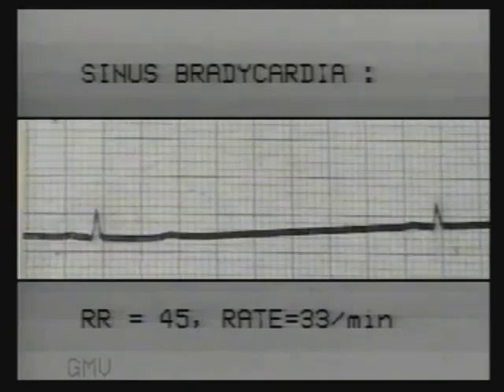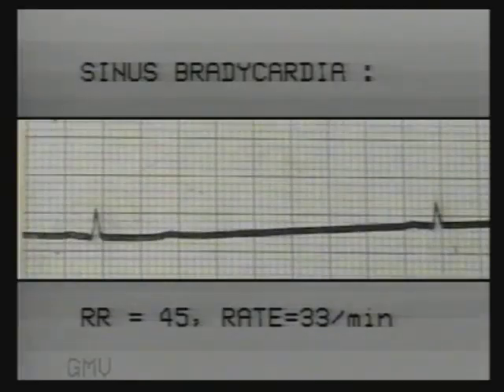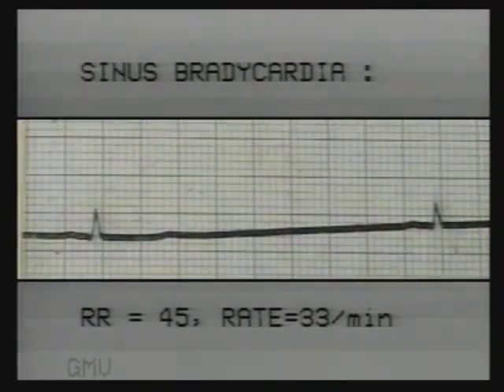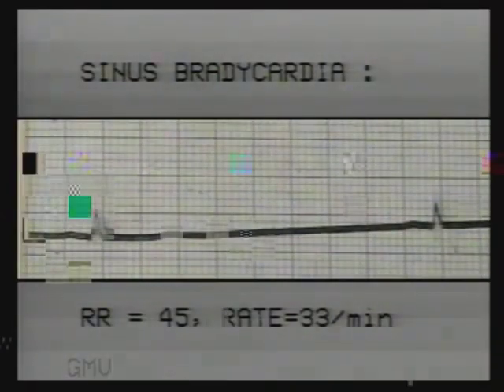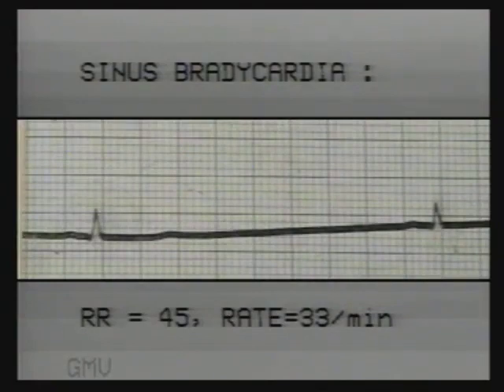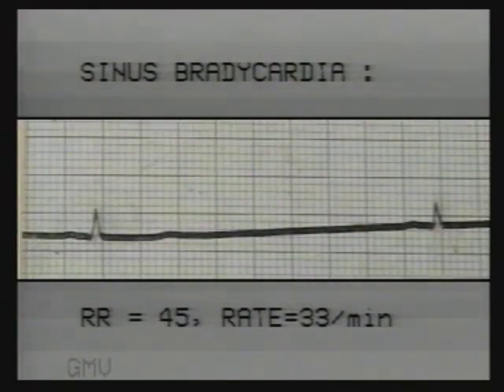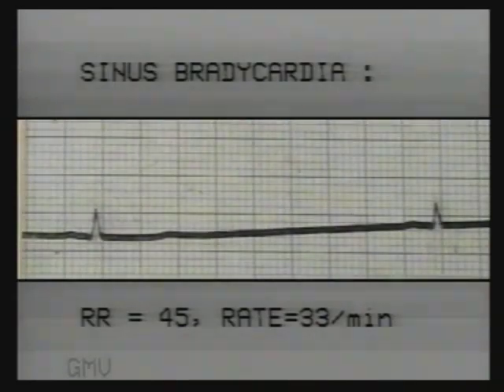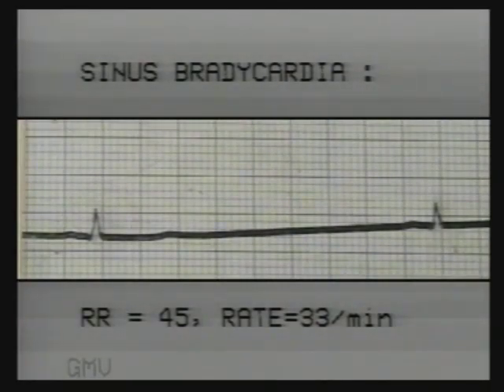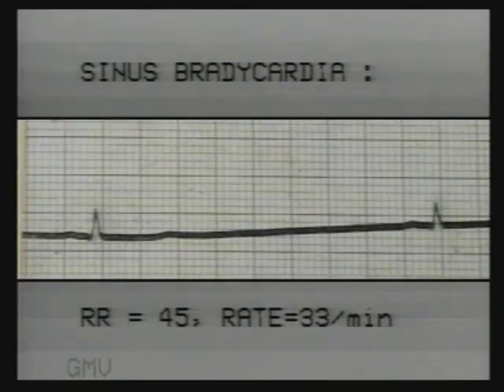This is another recording of sinus bradycardia with a heart rate of 33 per minute. The RR interval is 45 millimetres. Note the normal P waves and normal PR intervals. Sinus bradycardia is seen in athletes, during sleep and with drugs like beta blockers.